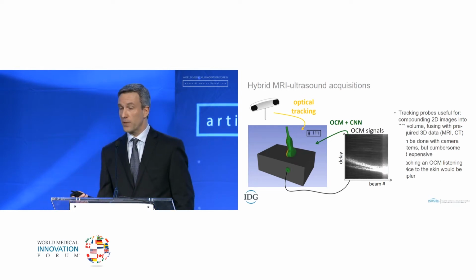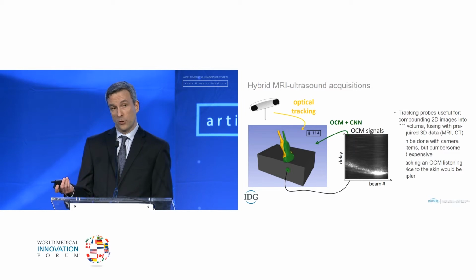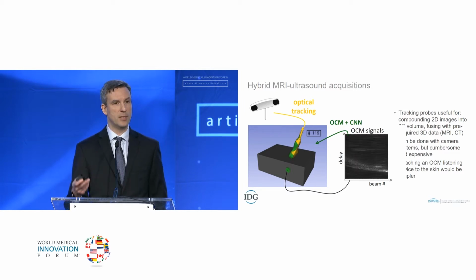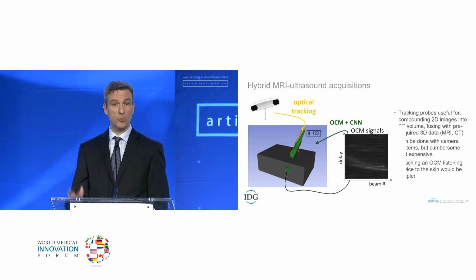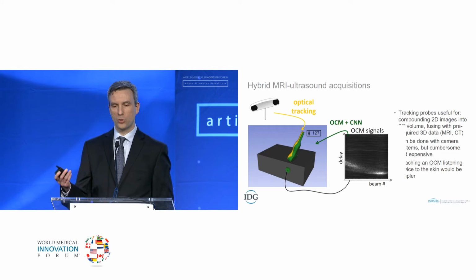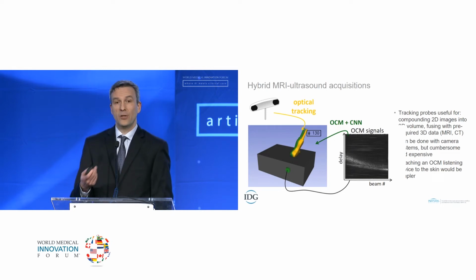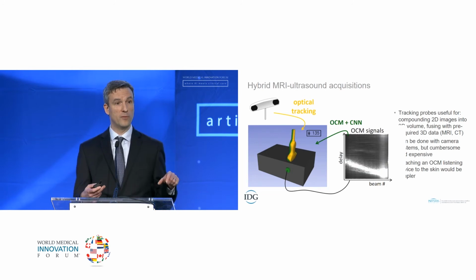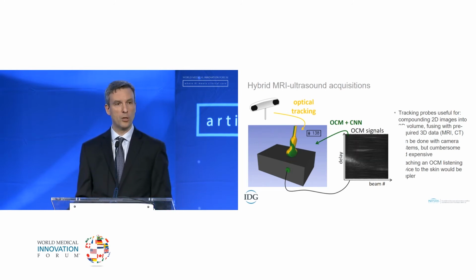This can be done with optical tracking, of course, but those camera systems can be expensive, and they can be cumbersome to use, and they need an open line of sight for them to work. So if the same information could be found instead by simply dropping a couple of listening devices nearby, it would be a lot more convenient.